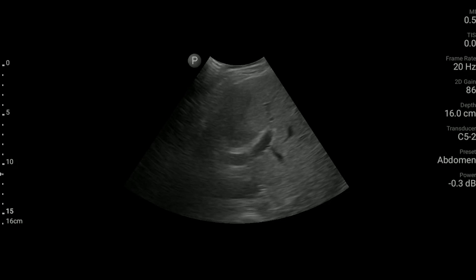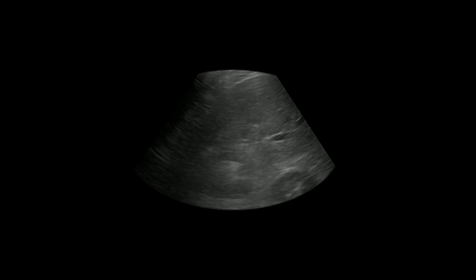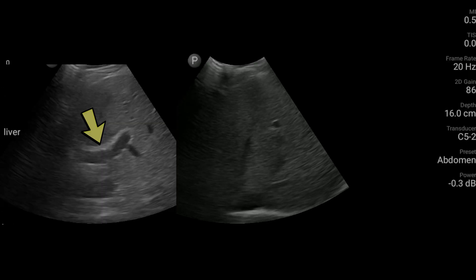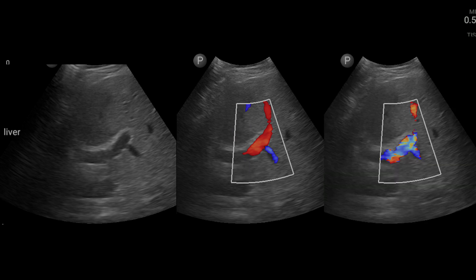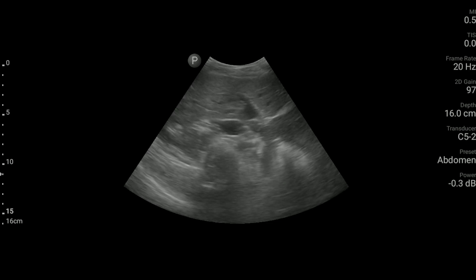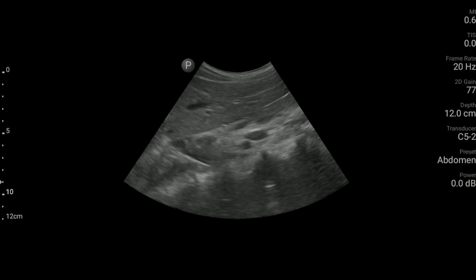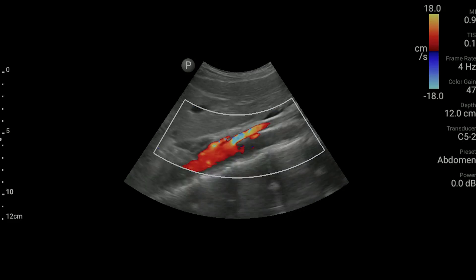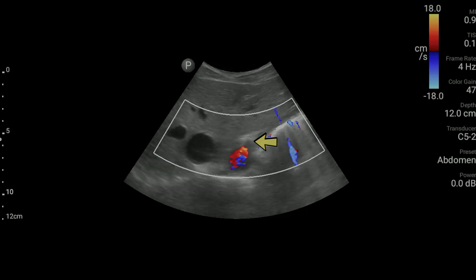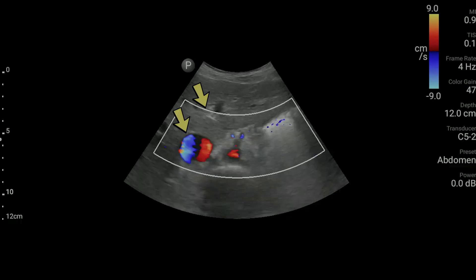The quality of images is good for a handheld ultrasound. The echo texture of the liver is well visualized from front to back, vessels are clear, and the portal fat is identified. The high flow setting clearly shows the direction of portal flow, while the low flow setting is appropriately overwhelmed by portal flow, but does fill out the intrahepatic IVC. The origin and angles of the celiac and SMA are identified, though this clarity wouldn't be possible on a larger patient. The branches of the aorta are visible on axial imaging, and on slow flow the hepatic veins and IVC light up as well.